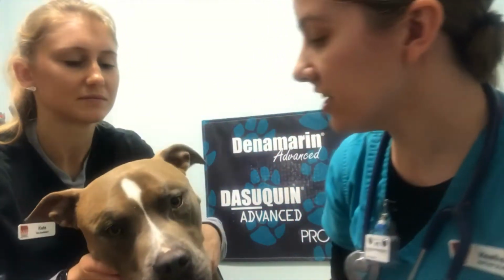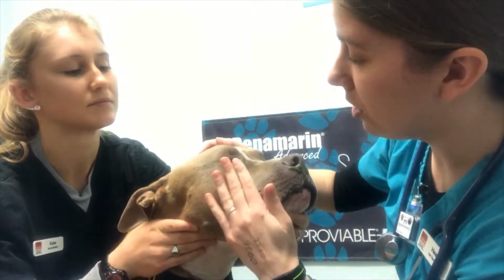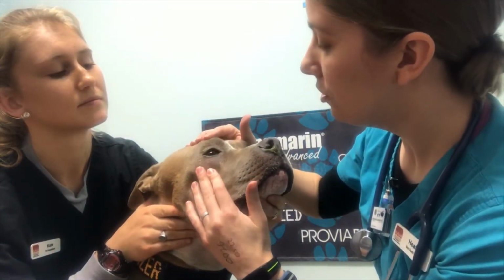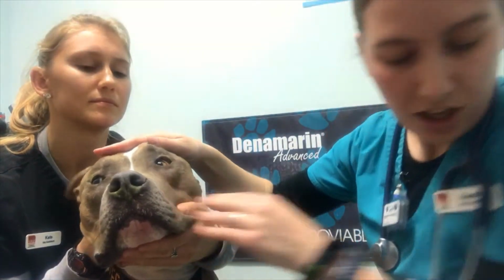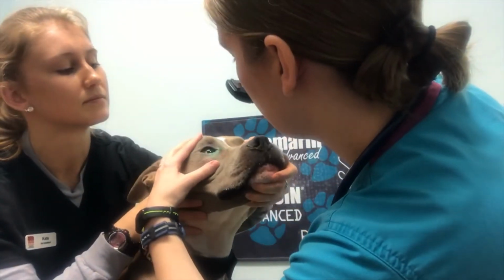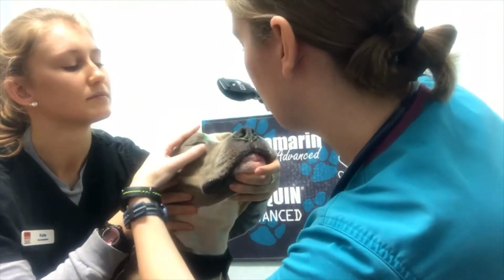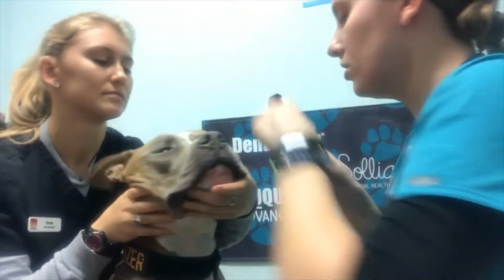So now once I've applied the stain to his eyes, I'm going to check with just visual inspection to see if there's any stain pickup. That stain pickup will look like a bright green blotch on the eye. Visually at first I don't see any stain pickup in either of his eyes, but I will also check with one of our black lights, ultraviolet lights here, to see if anything has picked up. This just gives me a little bit of a better look. Making sure I'm looking under the eyelid so his eyes rotate so I can check all over. Eyes good.